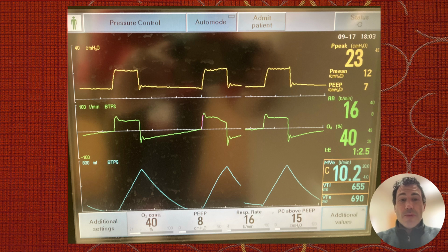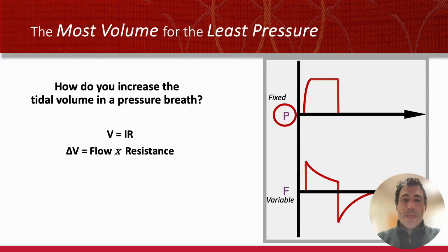Here's an example of inspiratory work of breathing on pressure control. Pressure goes on, it turns off at a set time, and in the middle you see this sustained inspiratory effort before they breathe out. And you notice here they breathe out with this long, continuous exhalation, not this nice backwards skiing down a hill. Something's not right with this patient. Working hard in, taking a long time to breathe out. We're not doing very well for this one, and we should try to look at what's causing these problems.